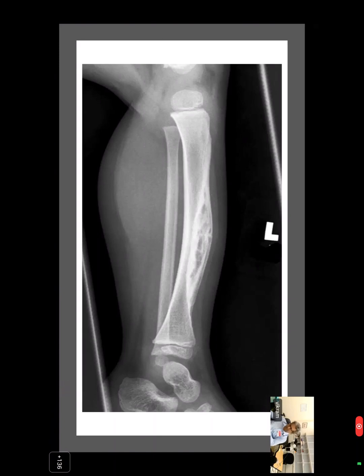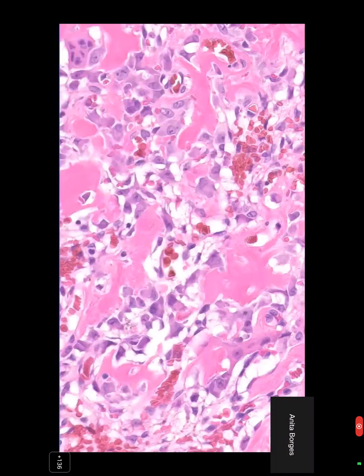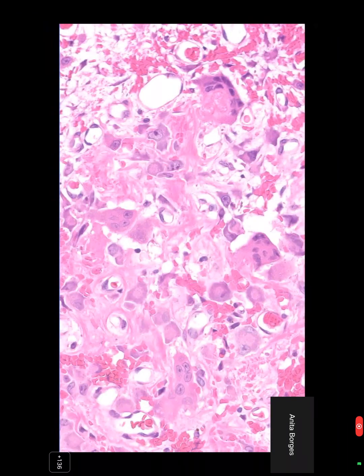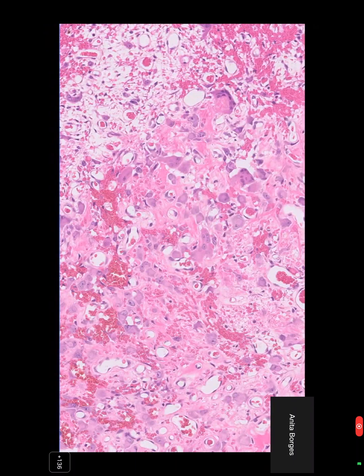Case 9, since we have a few minutes, does someone want to describe case 9? You know, for these osteoblastomas, Vikram, can I just make a comment? And maybe if you could go back to one or two of your sections. You notice the intense vascularity that you see in an osteoblastoma. You see these capillary-sized vessels, and it's seen so well in this osteoblastoma. I find that quite helpful, actually.